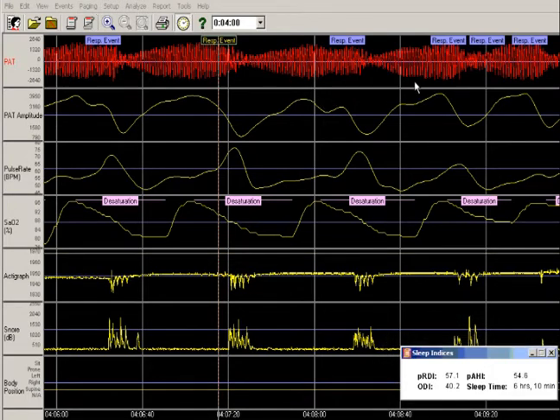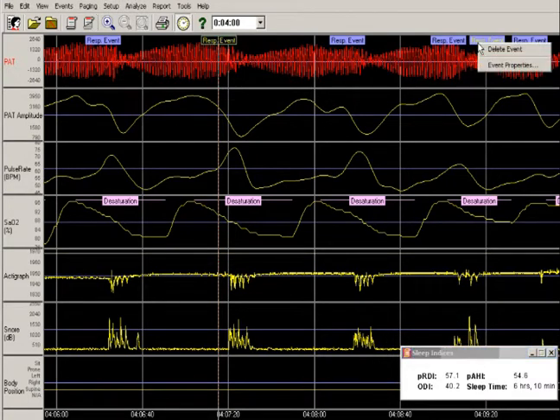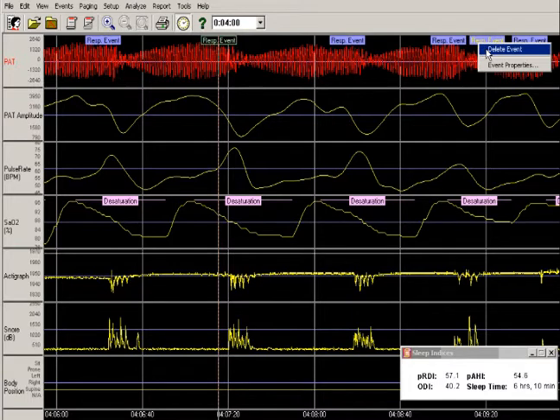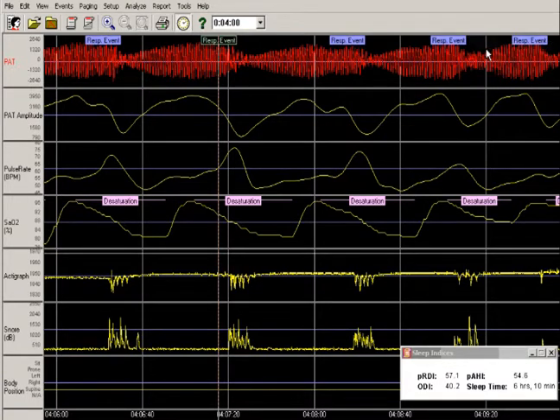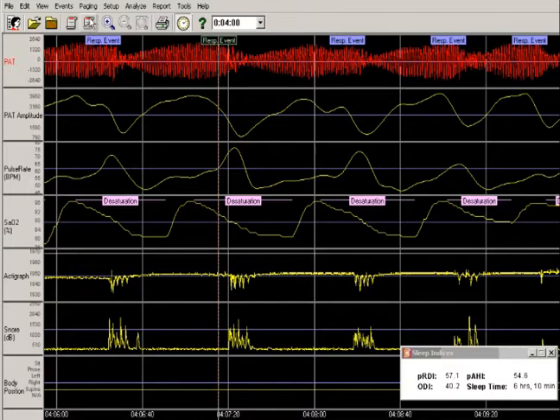Removing an event is just as easy. Right-click on the flag and select Delete event. Scoring is updated automatically.